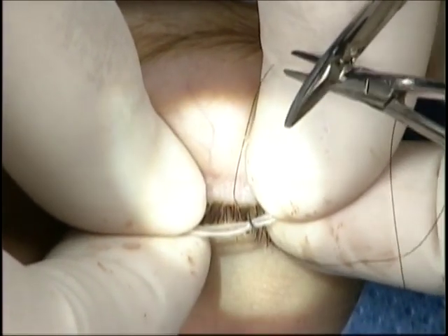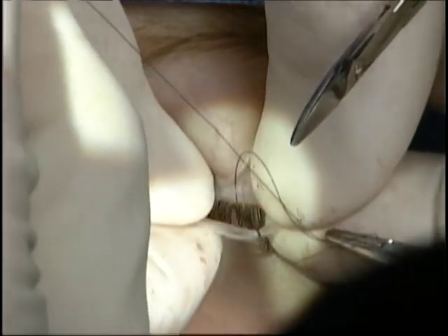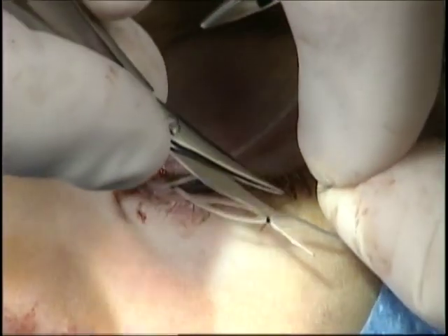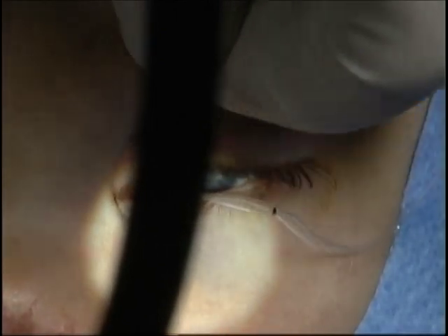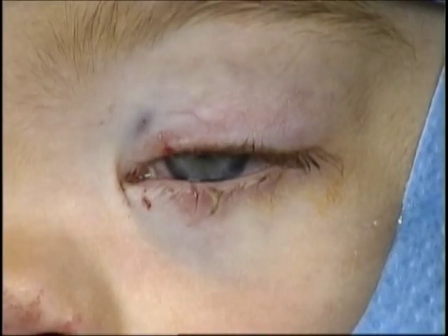The end of the stent that had been previously retrieved from the nose can then be pulled from both the stent from the upper and lower canaliculus, down the nasolacrimal duct and into the nose. The stent can then be tied and allowed to retract into the nose, completing bicanalicular intubation.